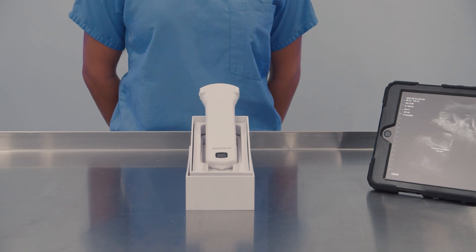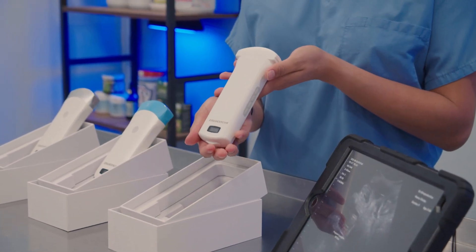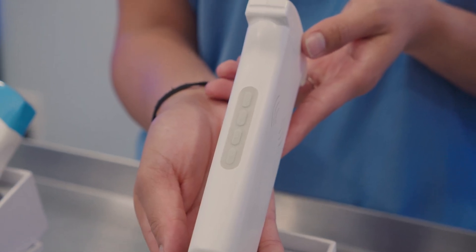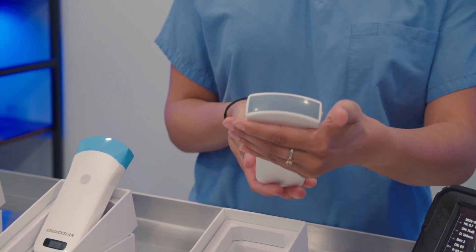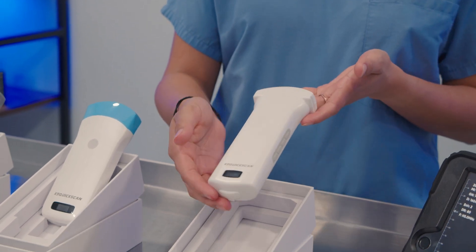The Q6 Convex color doppler is the premium option designed for professional use. It features 192 elements, which makes this probe one of the crispest imaging probes we've ever used. The Q6 offers full color imaging and a frame rate of 18 frames per second. The battery offers a 3 hour run time and it comes standard with a 1 year warranty.